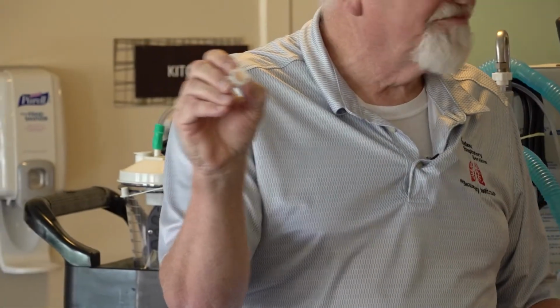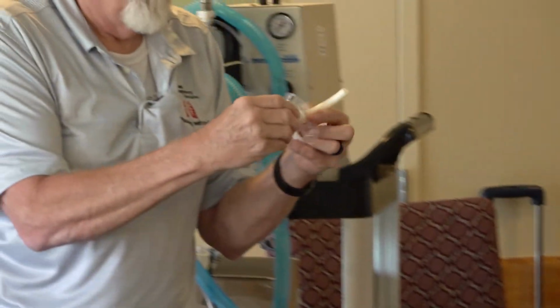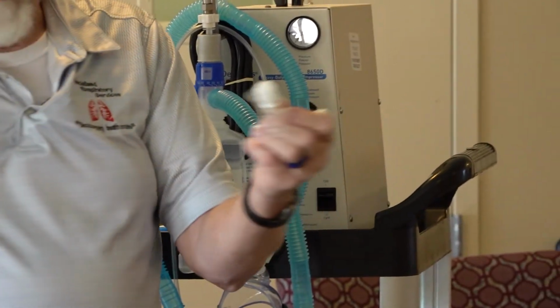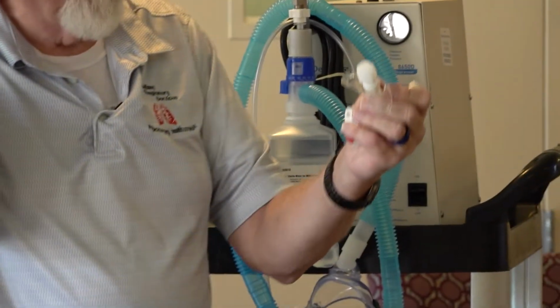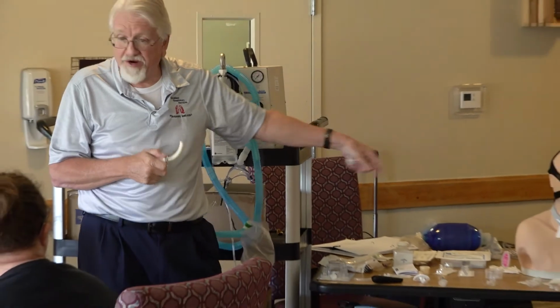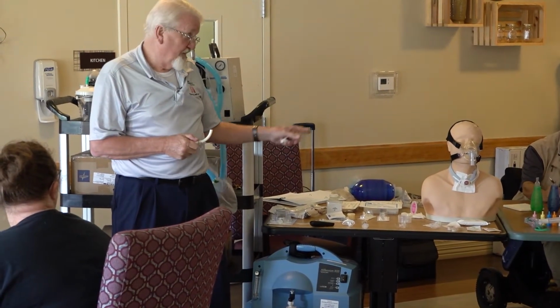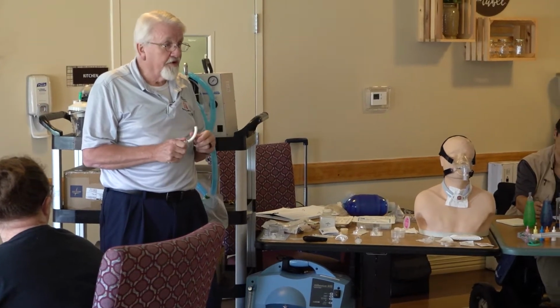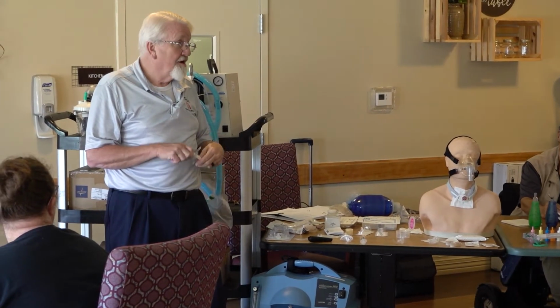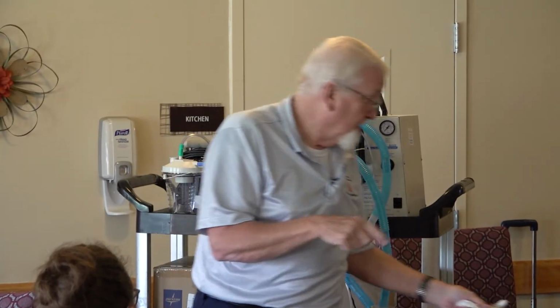And then this is just kind of a generic cap that will fit most any hub. The reason I point that out is, if you go into a patient's room, say Bob, and you see that red on there, if you don't know what's going on because he's got red on, don't do anything with him until you go and find out, either from your RT in-house or probably your ST is going to know.